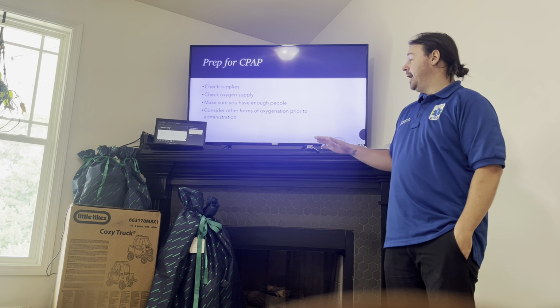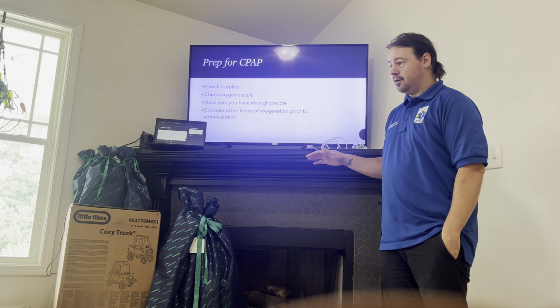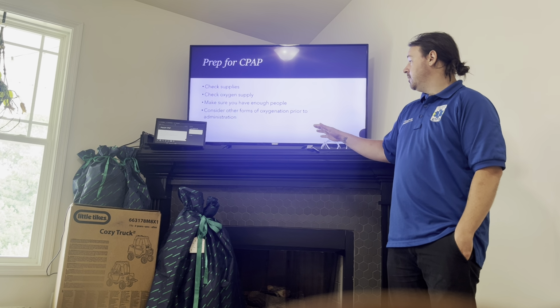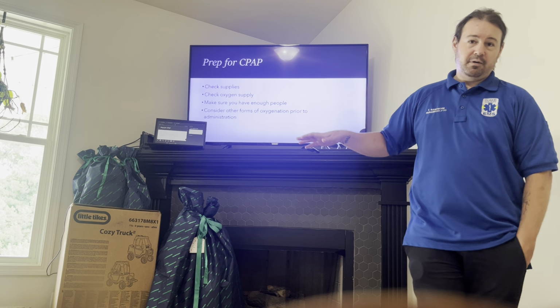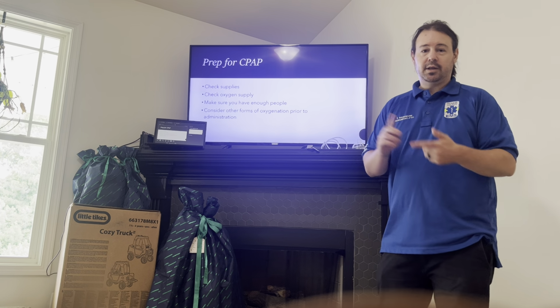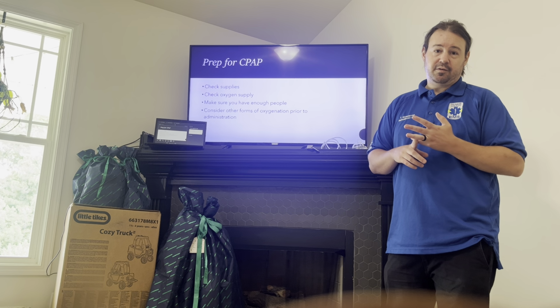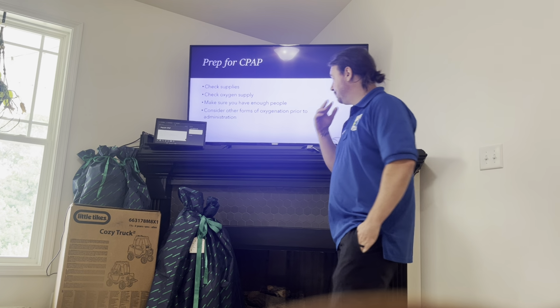I would not delay the administration of CPAP for the extra providers, but if you have the ability to get someone there in a timely manner, it would be easier for you. Then obviously consider another form of oxygenation while you're preparing the CPAP, if at all possible. That means placing these people on cannulas or non-rebreathers, or even ventilating them with positive pressure while we set up our equipment and get prepared.